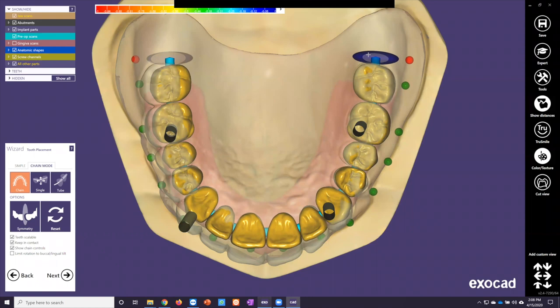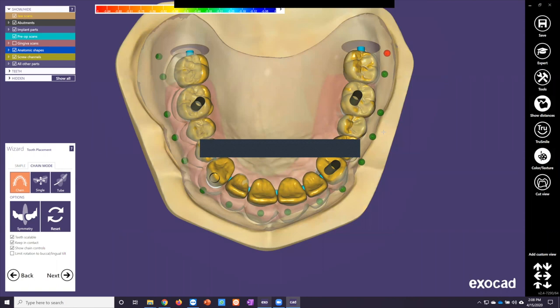And Lucas, while you're doing that, some folks here are wondering, that new library that you mentioned, are you using that right now or not? If so, this library is our exocad generic library. Gotcha. Is it possible to switch to the new library? I think folks are excited to see it. Yeah, let's take a look at that here.